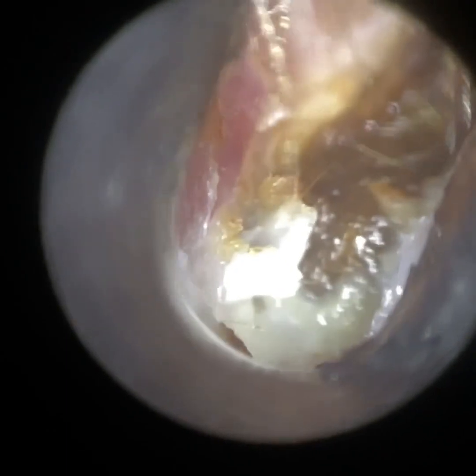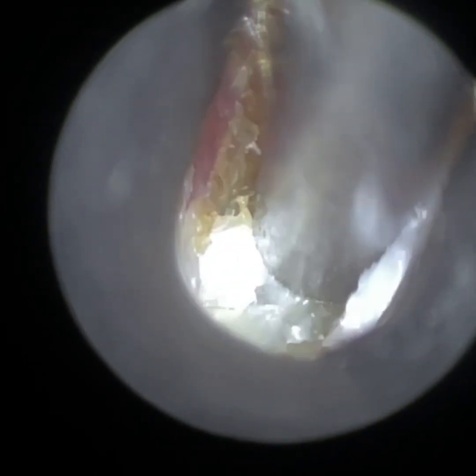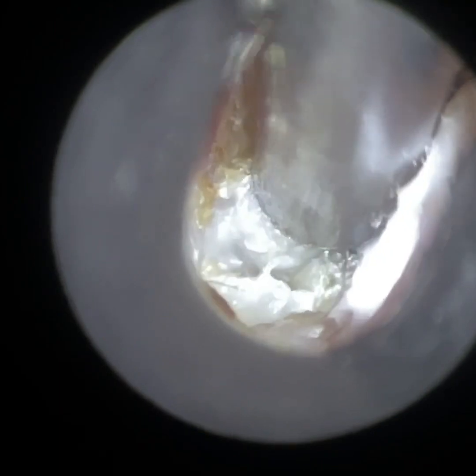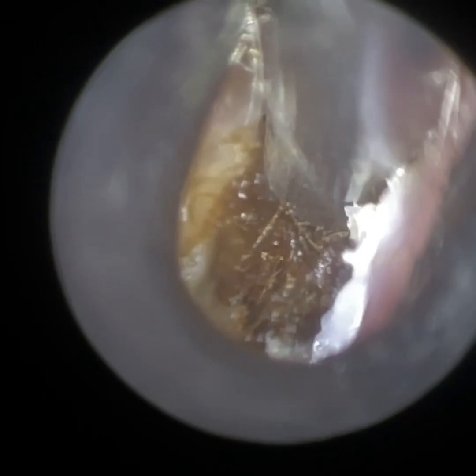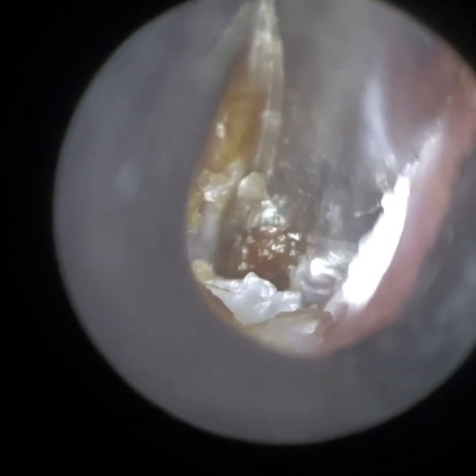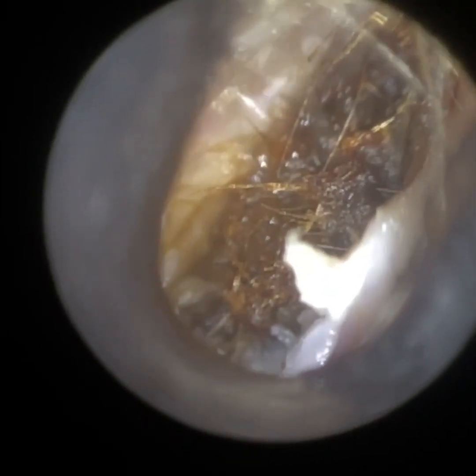I'm just dilating the ear. This remaining bit of wax and keratin is actually impacted on the eardrum, so I've just adjusted the focus. I'm trying to lift this up and away — if I can detach and loosen and mobilise this skin adhesion, it should help me to mobilise the plug of wax and keratin and remove it. I've been really careful on the anterior canal wall — the sucker is in very close contact with the front part of the ear canal. Because we're medial, in this inner two-thirds, that is literally skin on bone — a very thin layer of skin less than 0.1mm in thickness — with an undercoat of periosteum, the intermediate layer between the skin and the bone. If you come in contact with the bony part of the ear canal, it can be really uncomfortable.